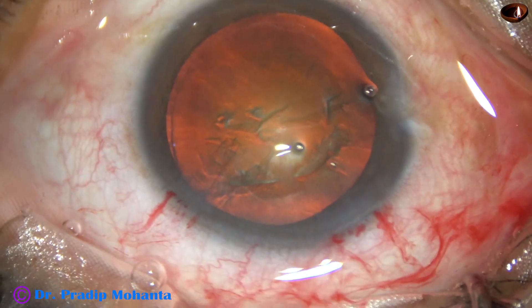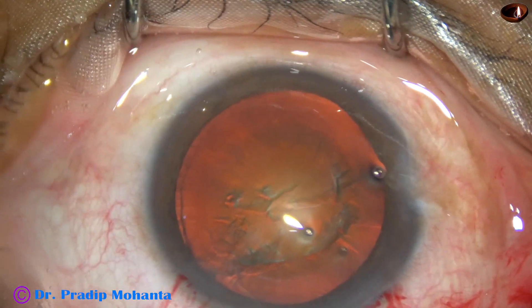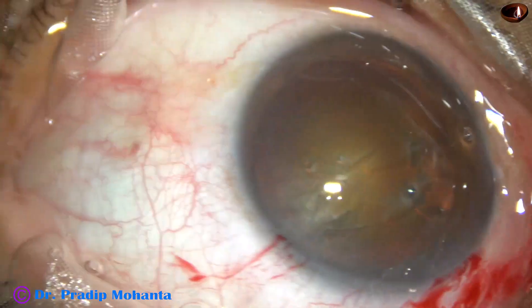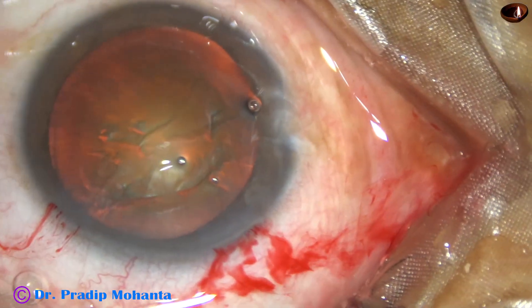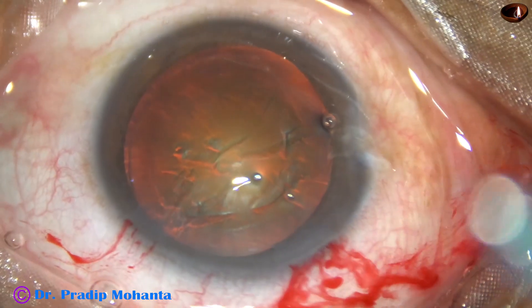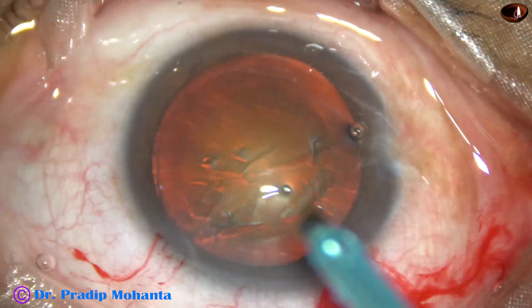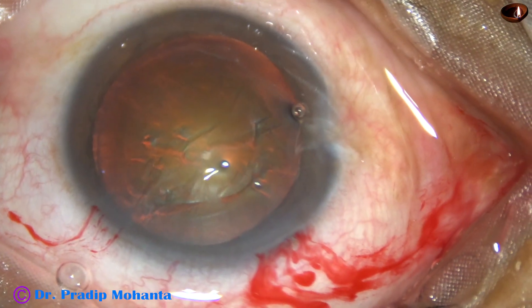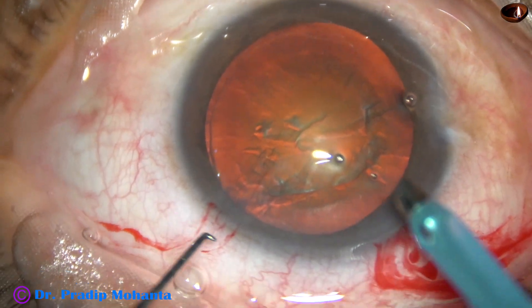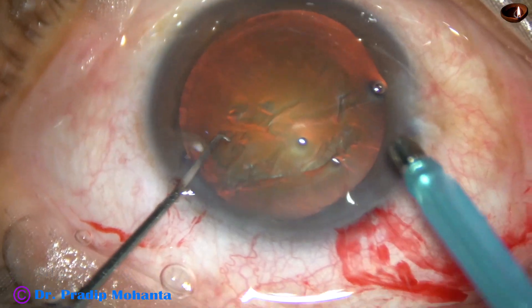Viscoelastic is again injected and the tip of the phaco handpiece is to be introduced. This is a totally unedited surgery. The machine being used is the Alcon Centurion. This is the EZ-tip. The tip goes beveled down.